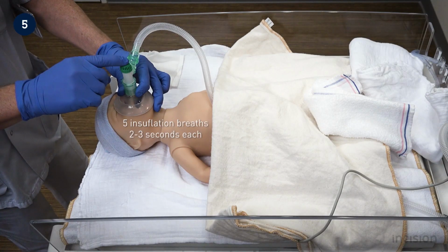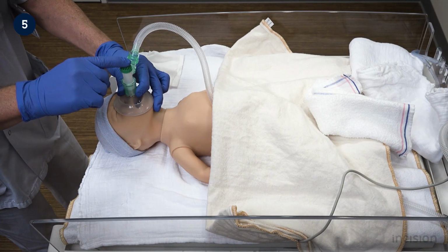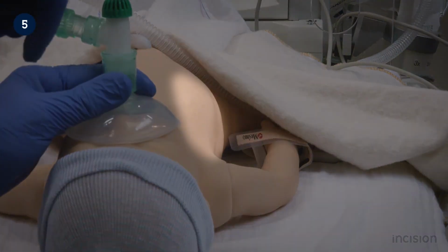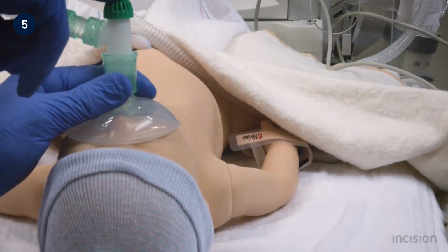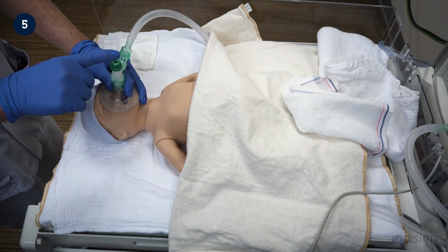5 inflation breaths are given, lasting 2 to 3 seconds each. Inflation breaths are given in order to attempt to force fluid out of the alveoli and replace this with air. If inflation breaths are performed correctly, thoracic movement will be visible, as seen here. It is paramount, therefore, that while inflation breaths are given, the chest is observed closely for movement following each breath.